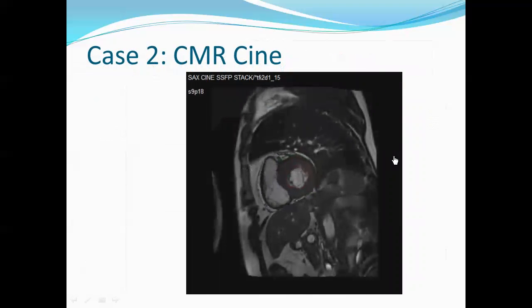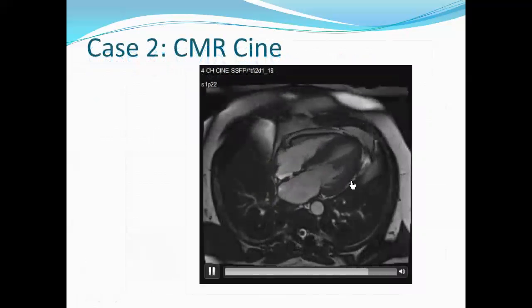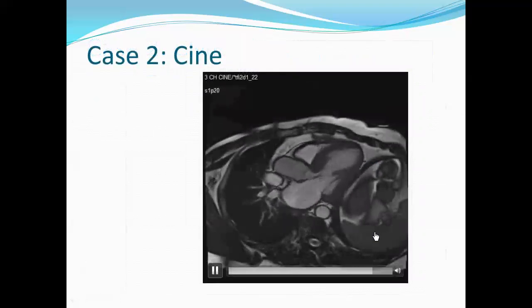Here's your short axis images. So again, you can just appreciate that the function here looks okay, but that the interventricular septum looks thick, and even the whole thing looks thick, but really the anterior septum are probably the thickest portions in diastole. Here's your 4-chamber, so you can appreciate that your left atrium looks enlarged. You've got this posterior directed mitral regurgitation jet, and you're starting to think that maybe there is SAM. Now, this isn't the view you typically are going to look for systolic anterior motion of the mitral valve, but you can appreciate a little bit here. Here's your view that you'll look at that.